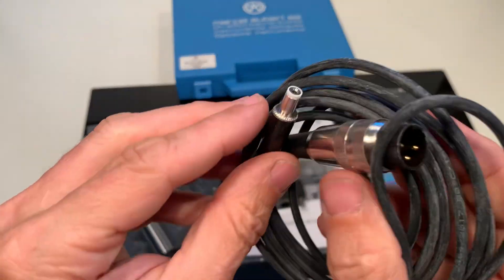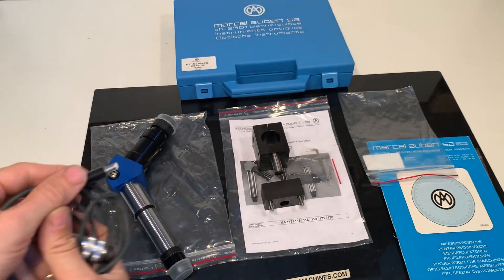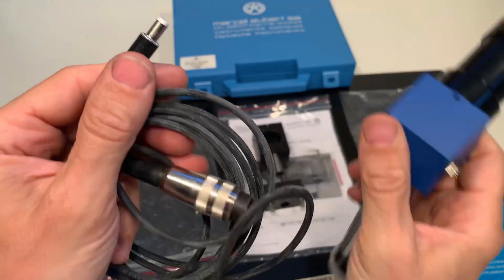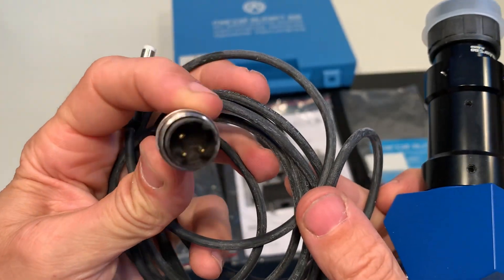This is for the light. So this one goes into the microscope on the side — you can see that. Click. And this one is on the other side.